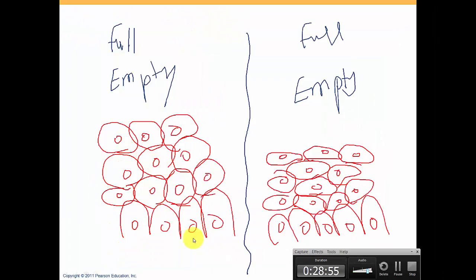So this epithelium will look like this in one time. It's very tall epithelium. It has 1, 2, 3, 4 layers. And it might become flatter at certain time. So 1, 2, 3, 4 layers, but they're all still shorter than this one.